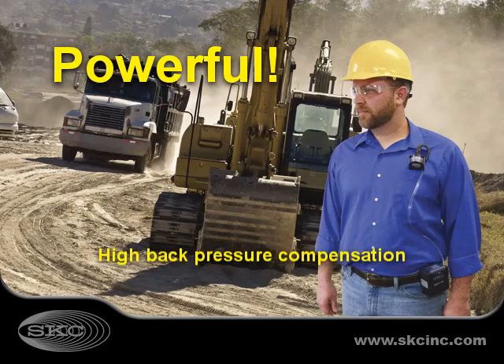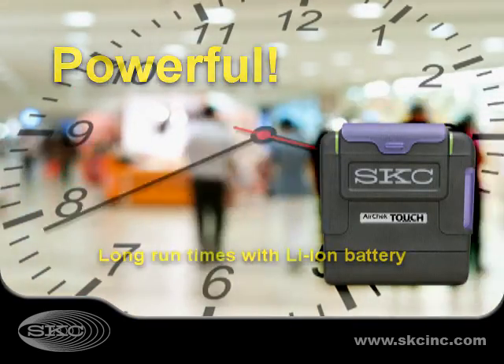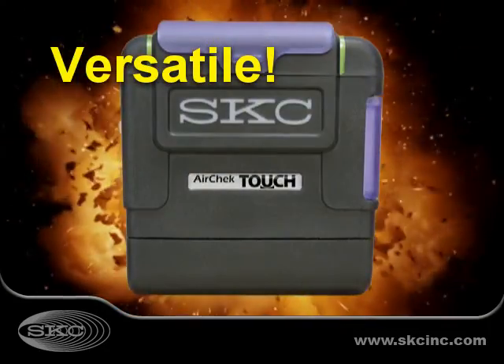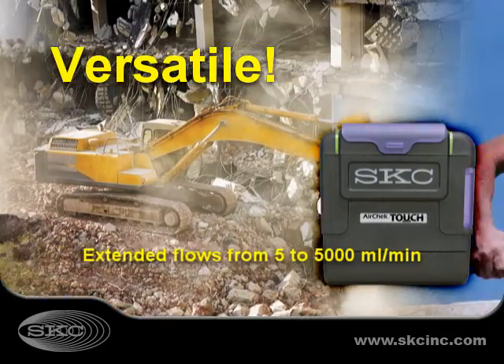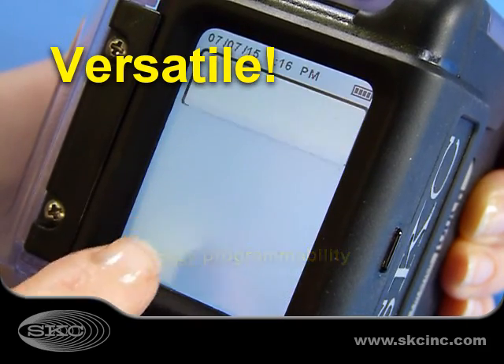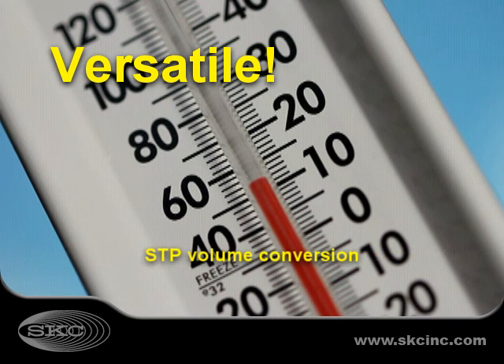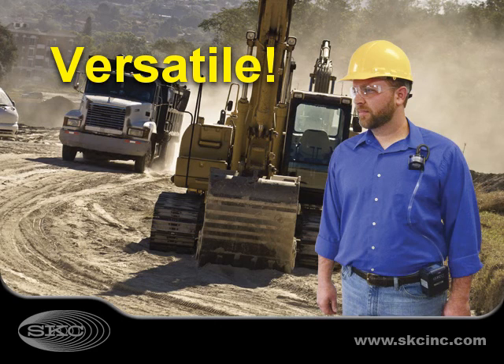Powerful AirCheck Touch provides high back pressure compensation and run times in excess of 12 hours. With its wide 5 to 5,000 mL a minute flow range, touchscreen or PC programmability, real-time flow display and automatic flow correction, AirCheck Touch is the best choice for today's sampling applications.